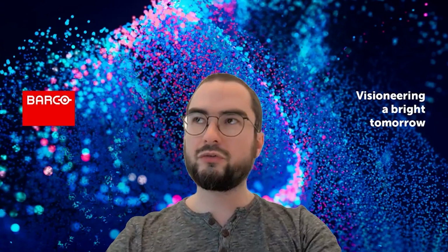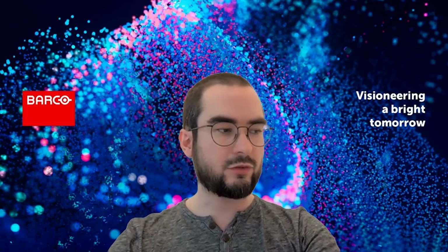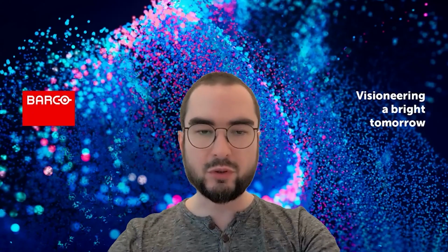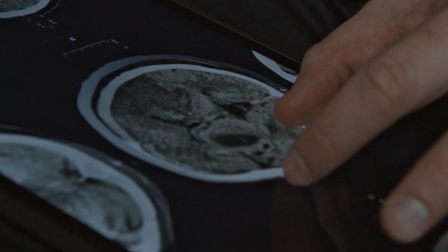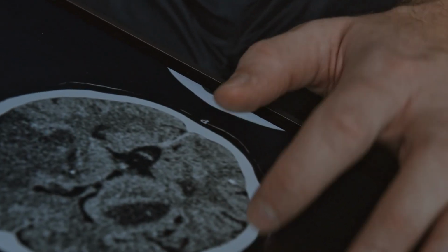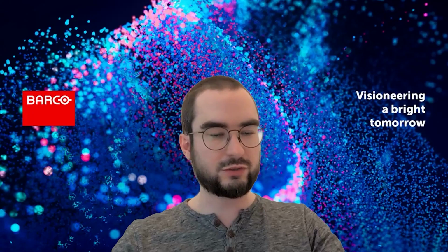So there are a few challenges that drive the need for this technology, and the summary is it's about depth. Depth is very important in medical imaging. As I said in my previous answer, the scans are slices and you stack them into a cube, and then you basically have a representation of the body of a human. That's a challenge when you want to prepare your surgery, for example.